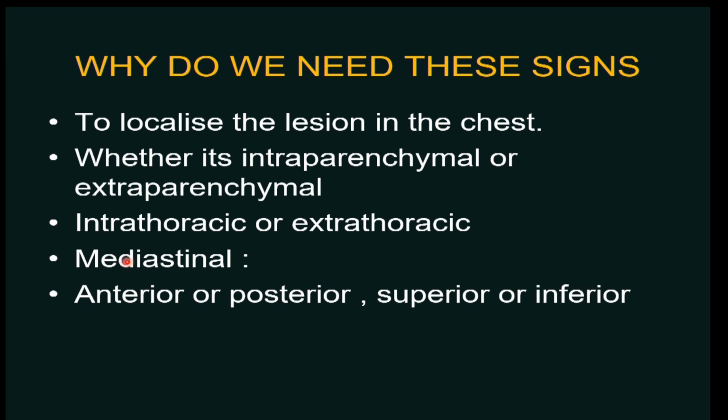So these signs help us to locate the lesion in the chest, whether it is intrathoracic, extrathoracic, whether it is intraparenchymal, extraparenchymal, and if at all it is a mediastinal lesion, whether it is anterior mediastinal, posterior, superior, inferior, and so on.